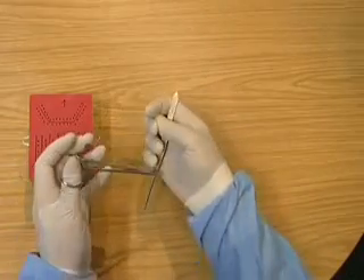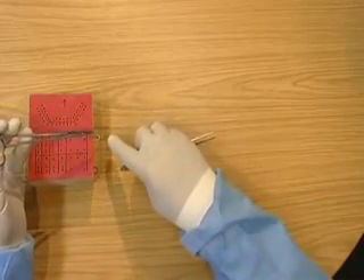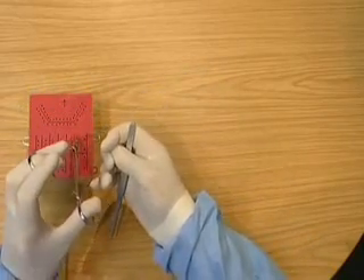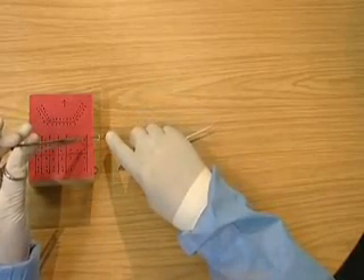Then going underneath once, tightening the knot with the first finger, over once, and then tightening the knot and presenting it to be cut.